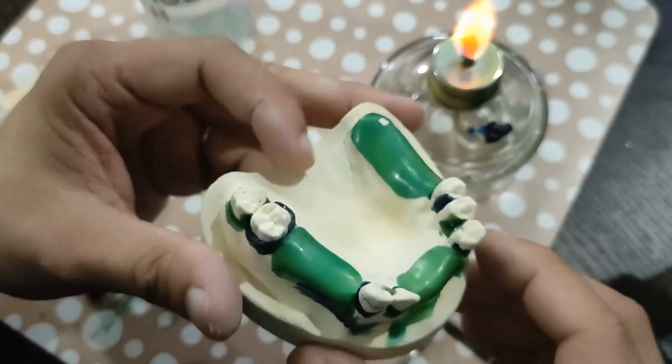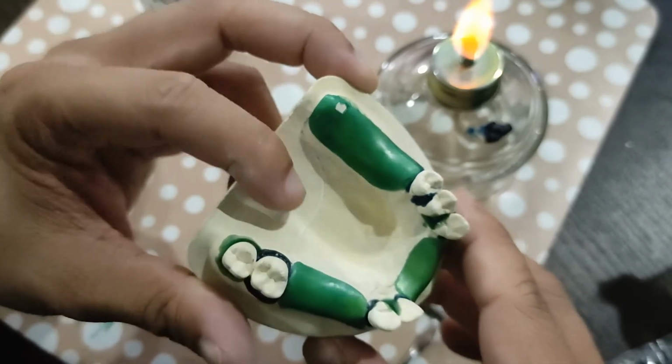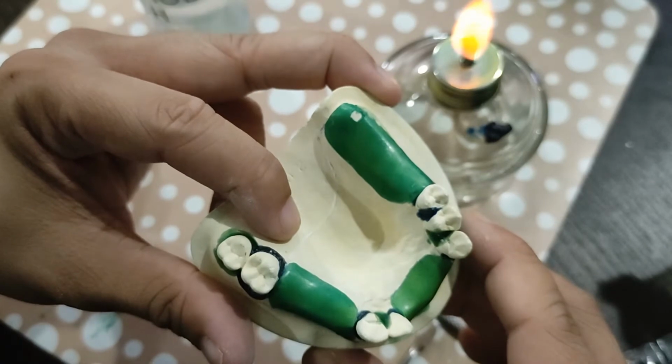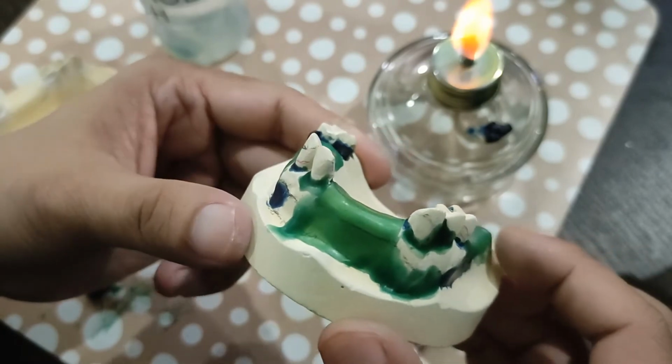Alright, so this is the relief done. Right, there's the beading here for the posterior border of the major connector. Tissue stop. I've also done the arbitrary blockouts.